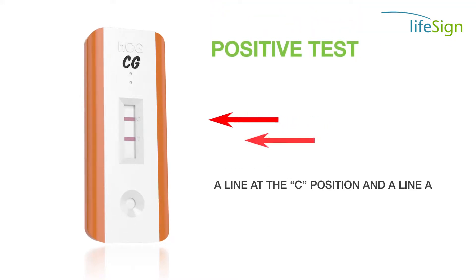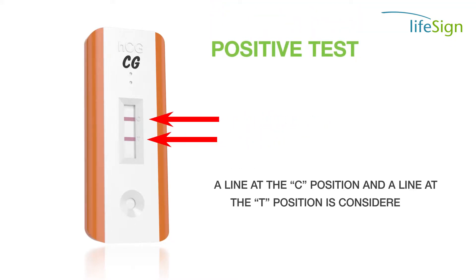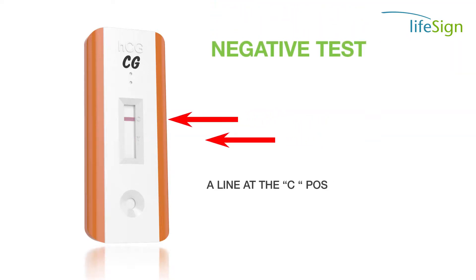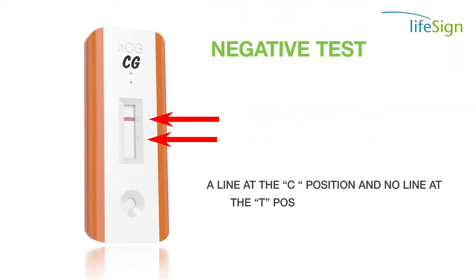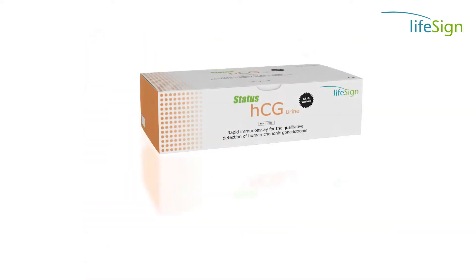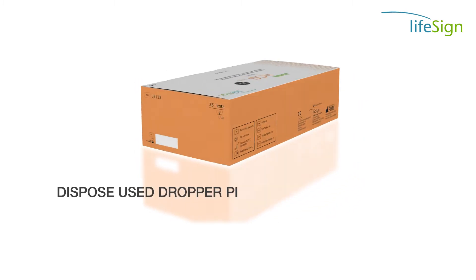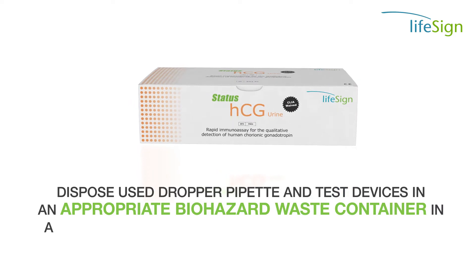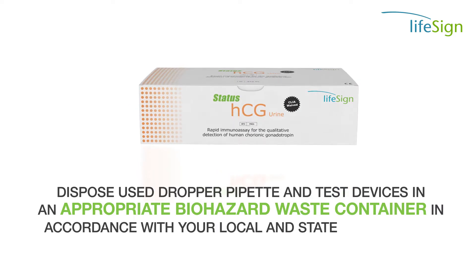A line at the C position and a line at the T position is considered a positive test result. A line at the C position and no line at the T position is considered a negative test result. Dispose of used dropper pipettes and test devices in an appropriate biohazard waste container in accordance with your local and state regulations.